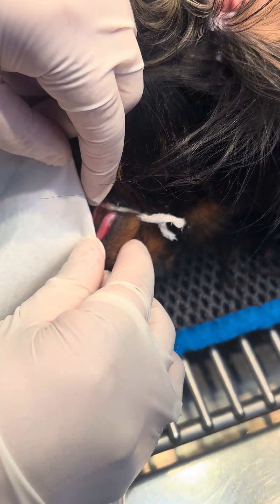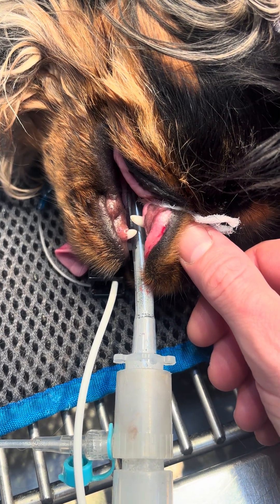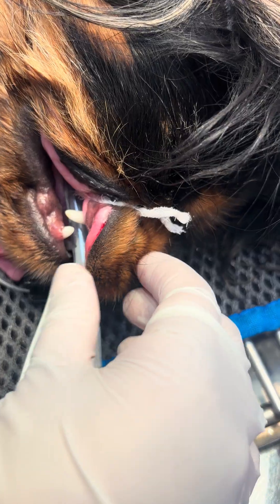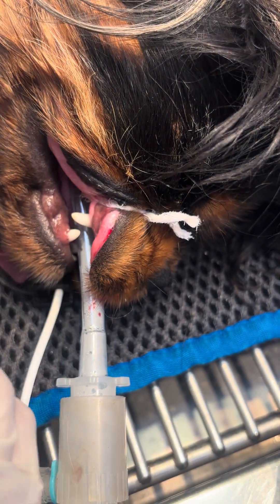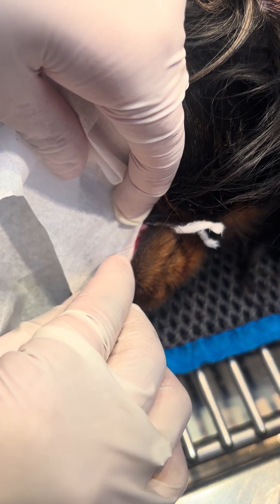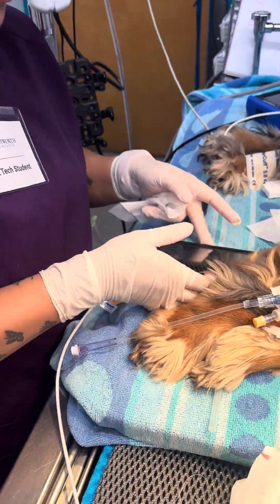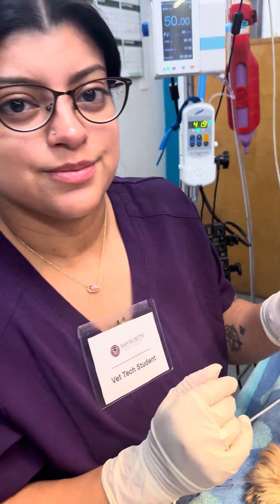I'm going to go ahead and blot one more time. All right, let's see what time we got — the time is two minutes and 30 seconds. All right, good job.